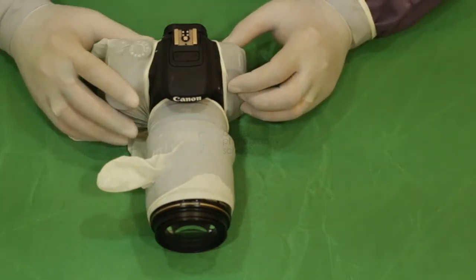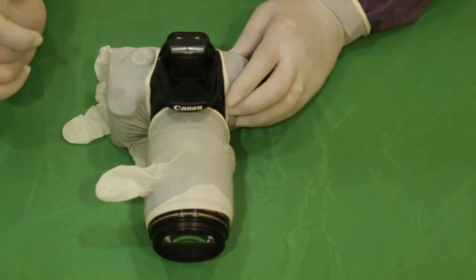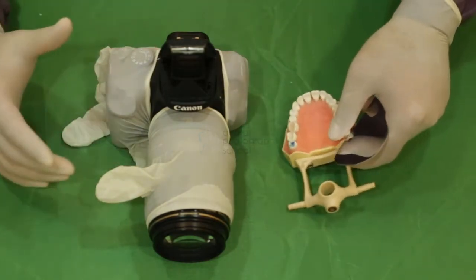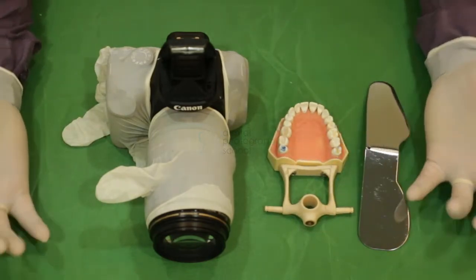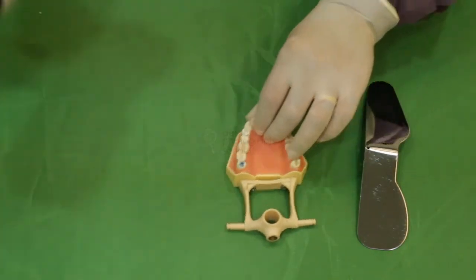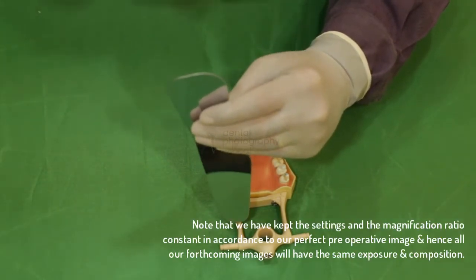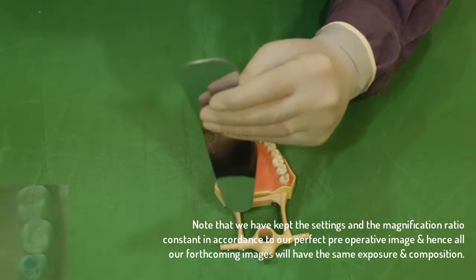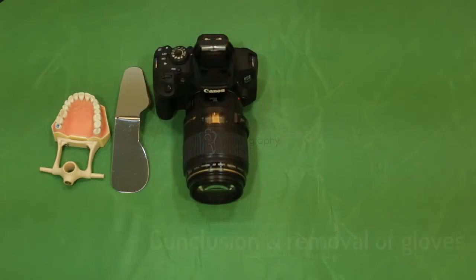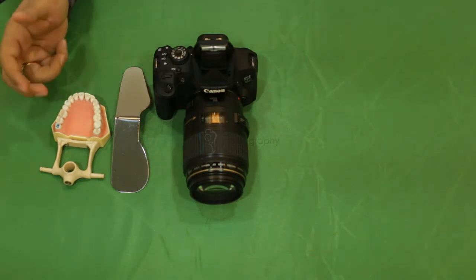Now you can turn your DSLR on and put your flash on. Confirm that you are ready to shoot. Once the DSLR is ready, I suggest that you change your own gloves and then start with your surgeries. Let's see if we can record the same shot with our covered glove system. This is the shot made using the covered gloves. Once you have done the surgery, you can cut the gloves and remove them, then remove the memory card and transfer the data to your laptop.